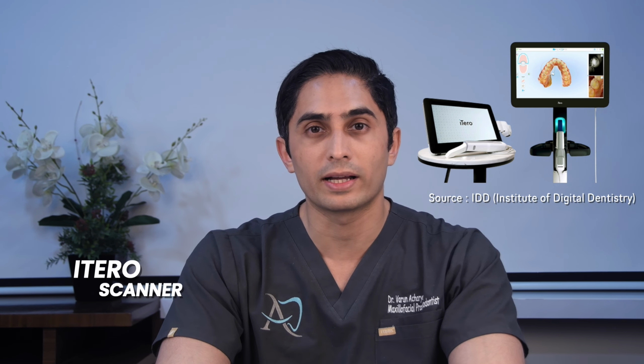There's one scanner which I still need to talk about, and that's the iTero. Now, iTero is the scanner which is recommended by the Invisalign company. They, of course, have a share in it as well. And it's supposed to be a very fast, very accurate scanner. However, there is a challenge with the scanner. Why I would not consider it for restorative dentistry is the scanner itself is quite huge. It has a huge head and a huge body, and it's just very unwieldy and difficult, especially difficult to manipulate in posterior regions. So for me, that scanner is not an option for restorative dentistry, no matter how fast or accurate it may or may not be.